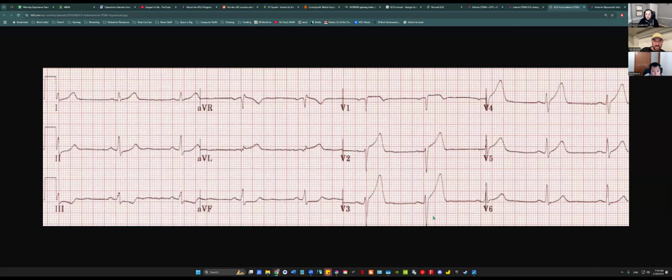The reason why you might hesitate a little bit for V3 and V2 is that the QRS spikes. Have you guys heard of early repolarization? Yeah, I've heard of it, but I can't talk about it. Usually the spikes have to be big enough to almost touch the other lead tracing. You end up with kind of a QRS that looks almost like this. It's like the heart overshoots to recover. But you need a really big QRS spike for that. This is not it. Okay.